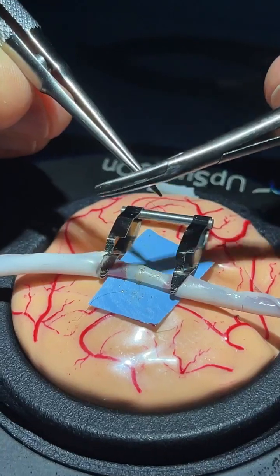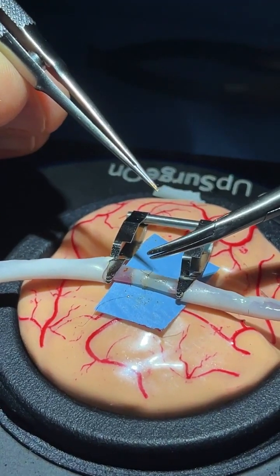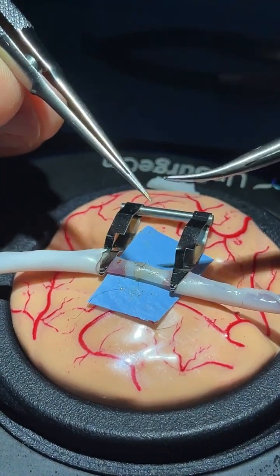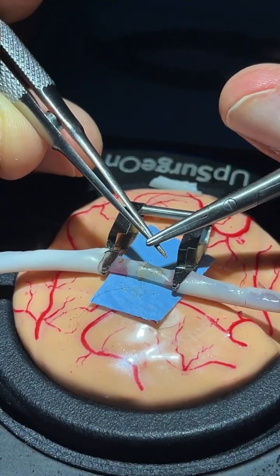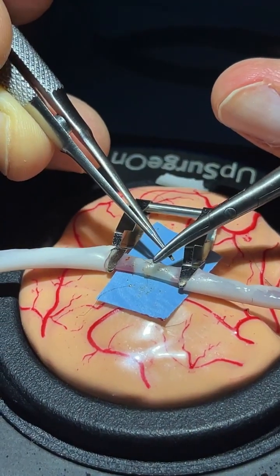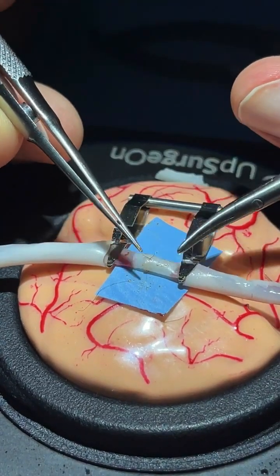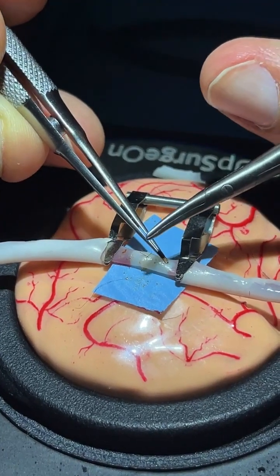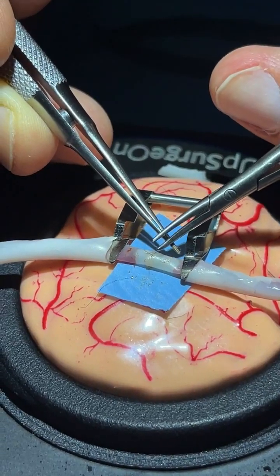If you start to have tremors, this is normal at the beginning. If you have tremor, you can use the forceps to support the needle — rest the needle on the forceps to decrease the risk of tremor. This is not a standard technique, but it is useful when you start to experience a little bit of tremor. You can place the forceps like that and use the needle to take something or to move the stitches.